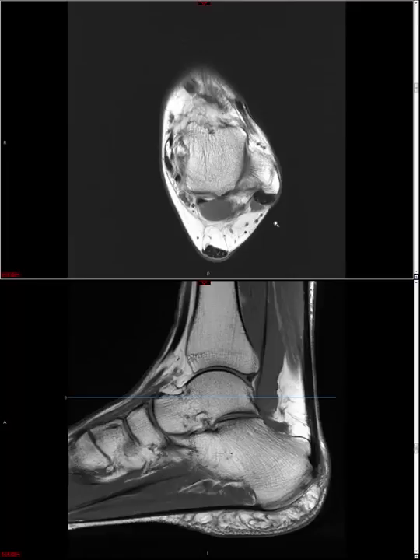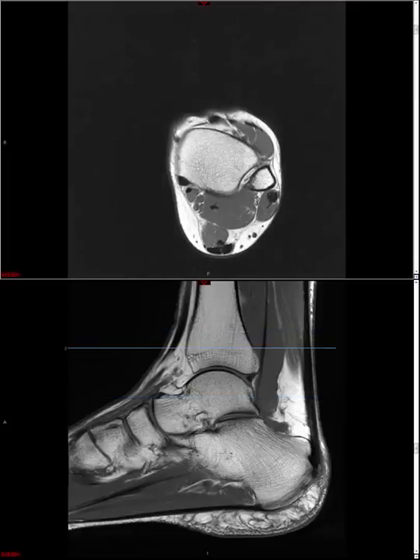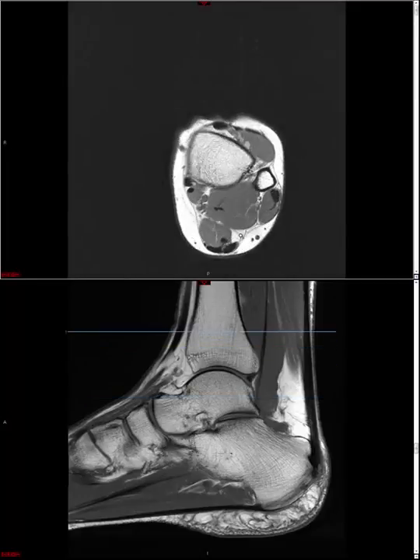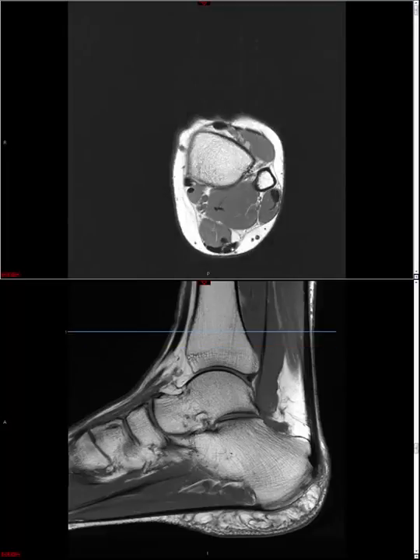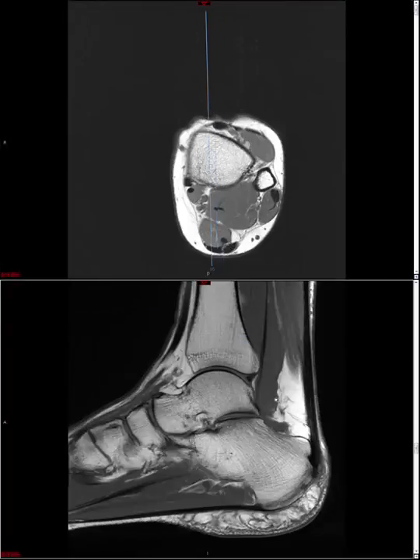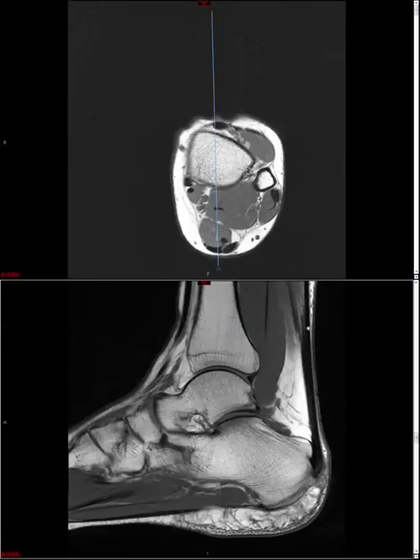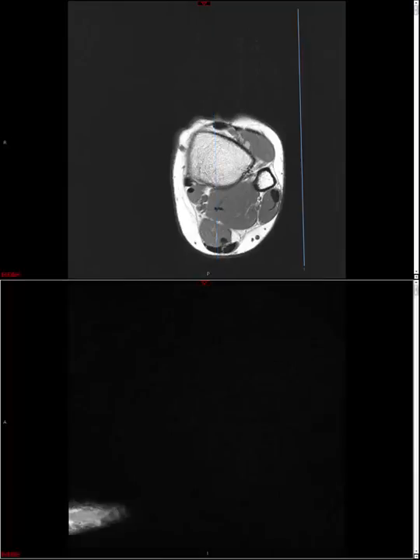Let's start by looking at the tendons. There are anterior tendons, lateral tendons, deep posterior tendons, and the Achilles tendon. Let's start with the Achilles tendon — this big tendon that is basically the confluence of your superficial posterior compartment musculature in the calf. Like all tendons, it generally has a homogeneous low signal appearance on all sequences.